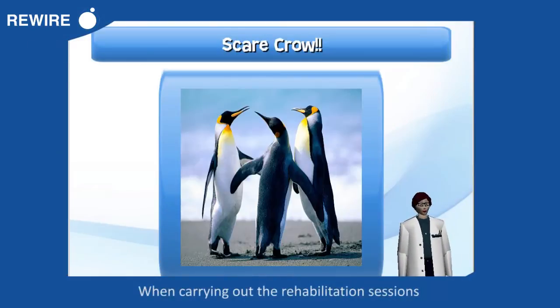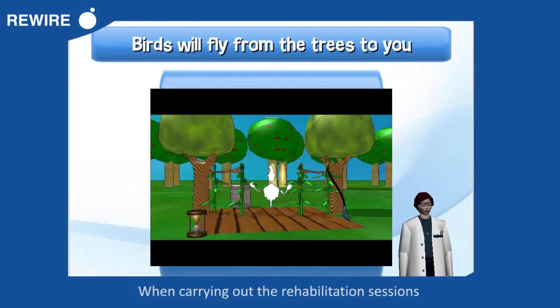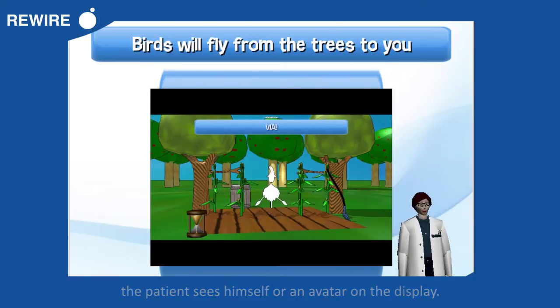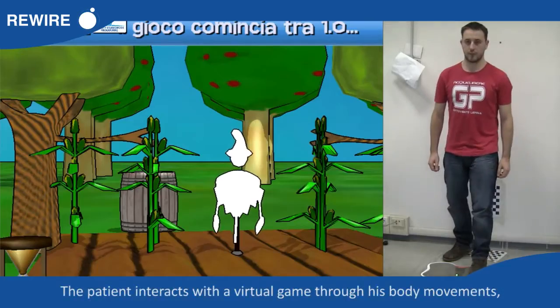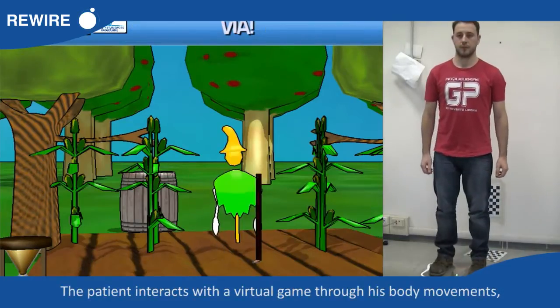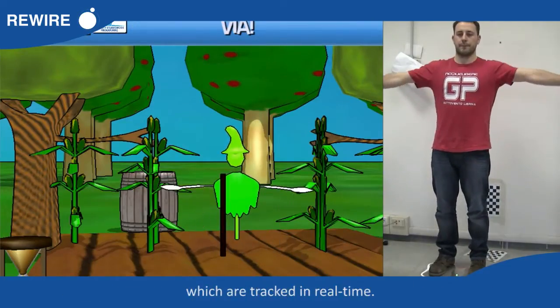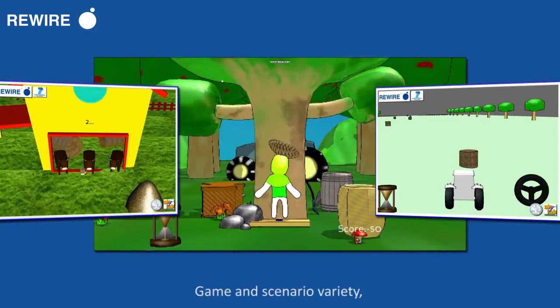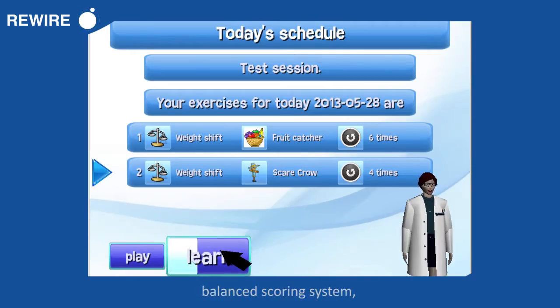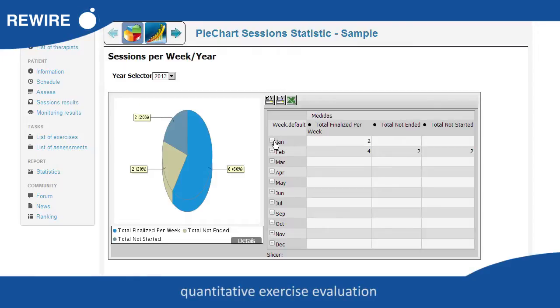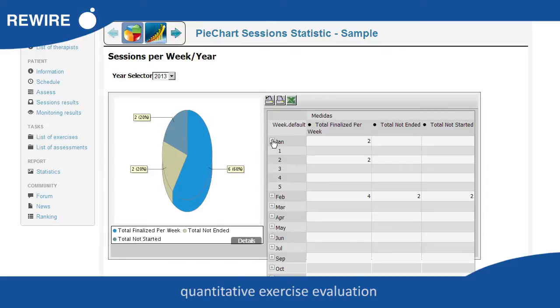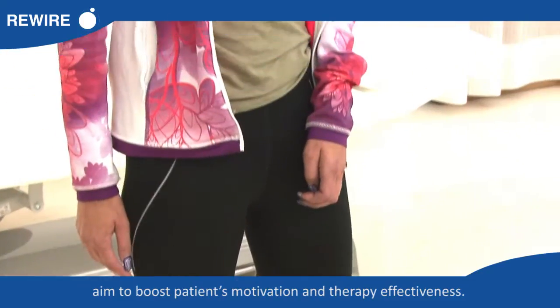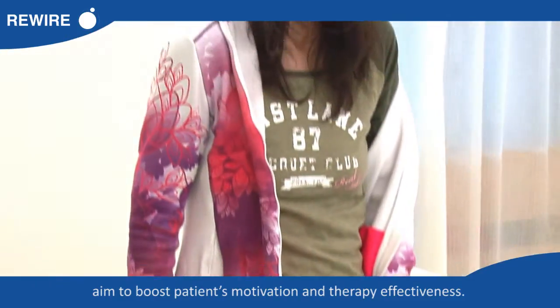When carrying out the rehabilitation sessions, the patient sees himself or an avatar on the display. The patient interacts with a virtual game through body movements, which are tracked in real-time. Game and scenario variety, a balanced scoring system, quantitative exercise evaluation, and audio-visual feedback aim to boost patients' motivation and therapy effectiveness.